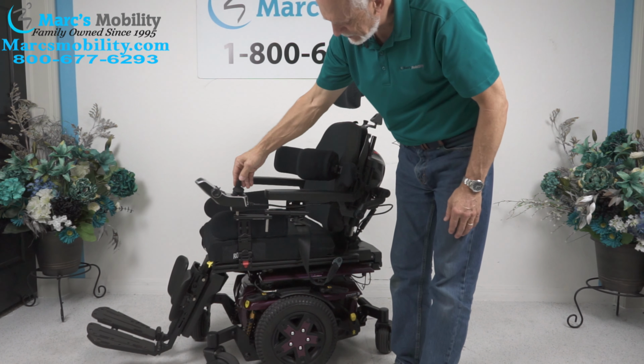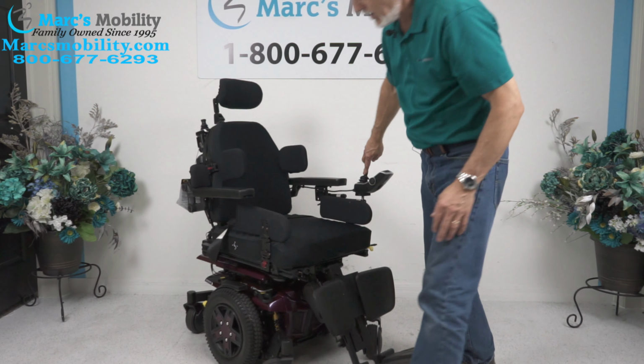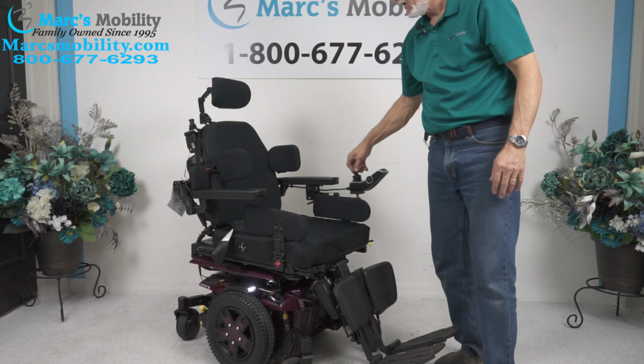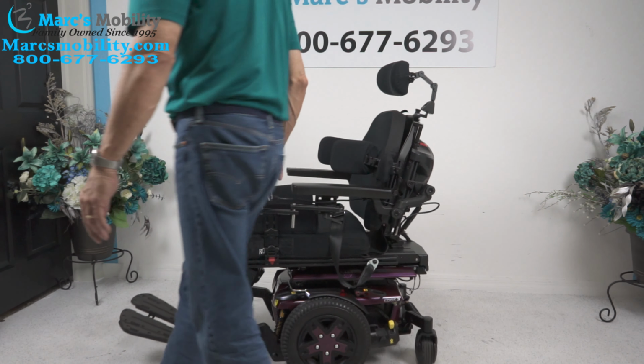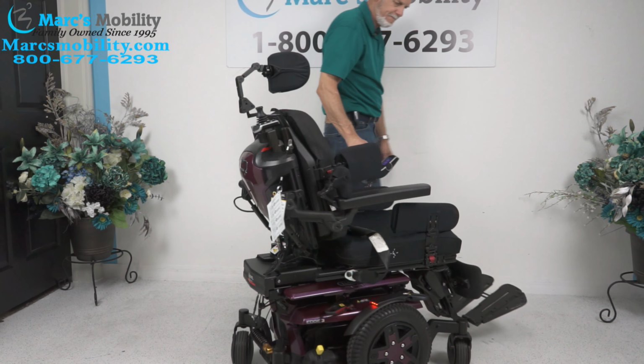You also have on this chair, on this side here, you have a button right over here, right under here, and those are your headlights. You have headlights, and you have tail lights. There are your tail lights, and there are your headlights.